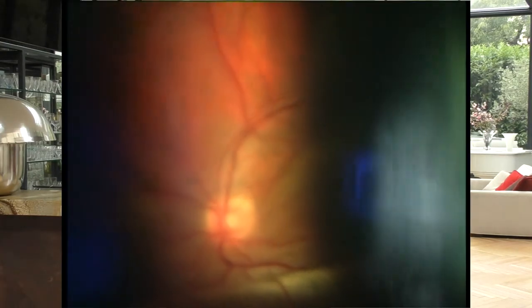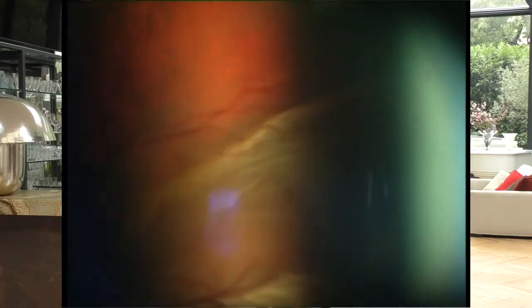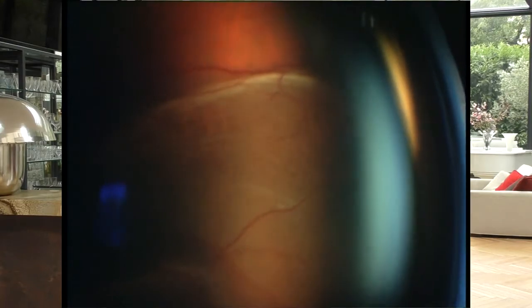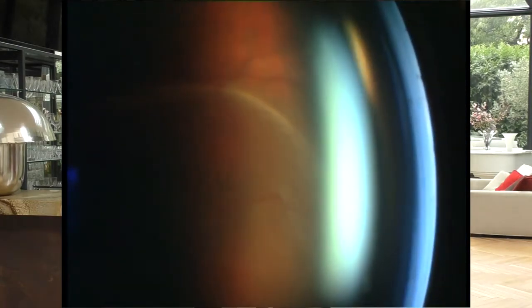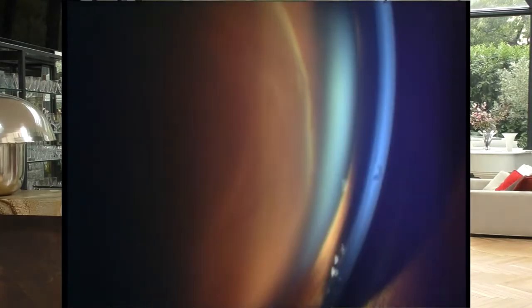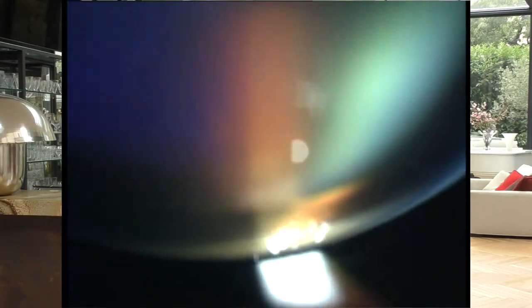Let's see what happened in the same phakic patient. Immediately we see that we have this beautiful overall appreciation provided by wide field lenses. We immediately see that the connection zone goes back up to 9–10 o'clock. And we can see the vitreous base.